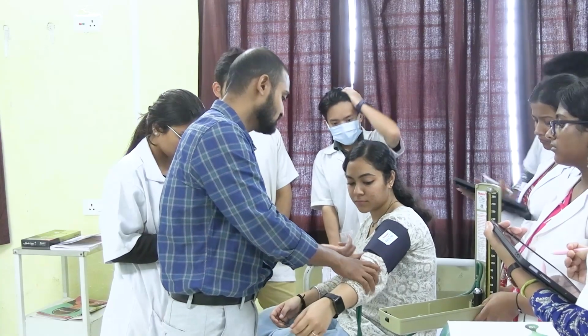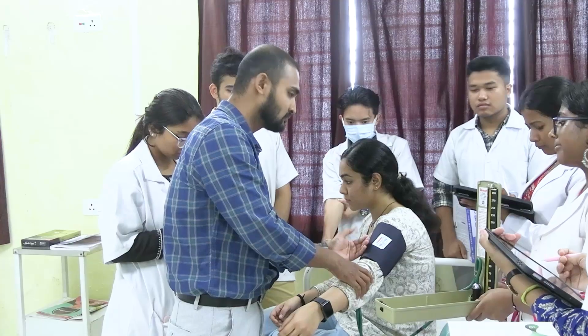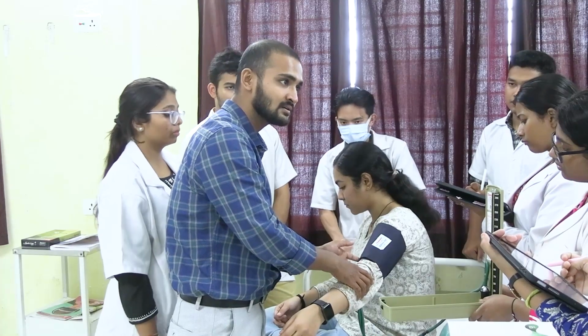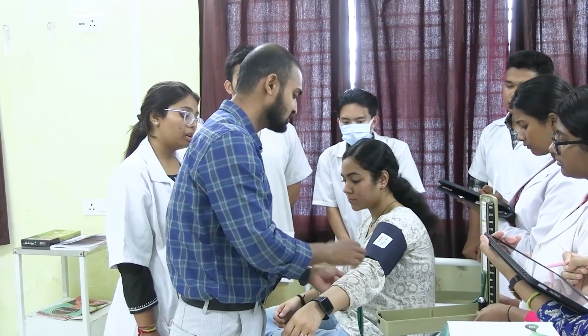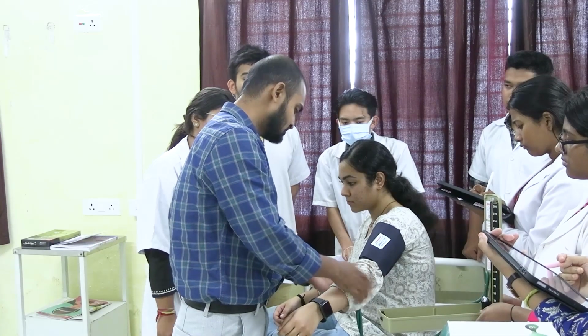So if the cuff is placed above the cubital fossa in the antecubital position, then only we can palpate or auscultate the artery. If we put it down, we cannot palpate or auscultate. The artery is not exposed properly. Okay, so this clothing shouldn't be present.